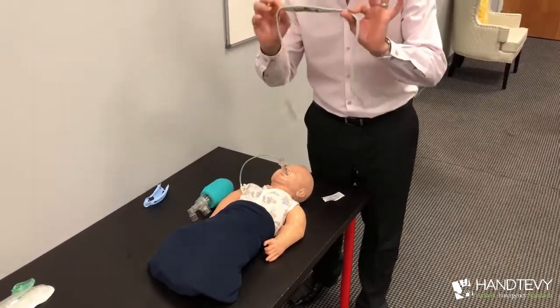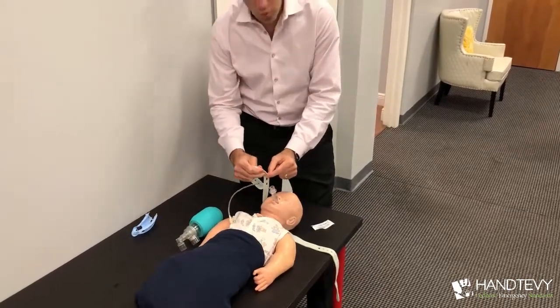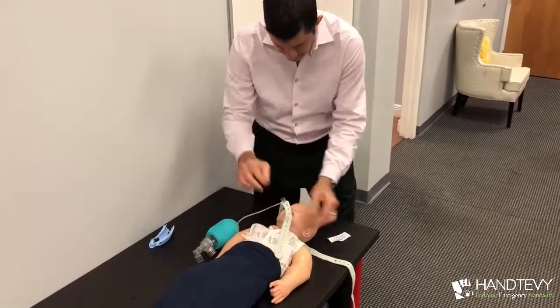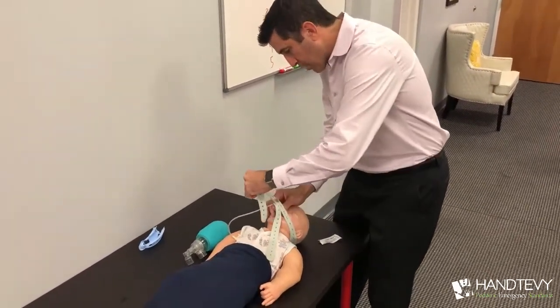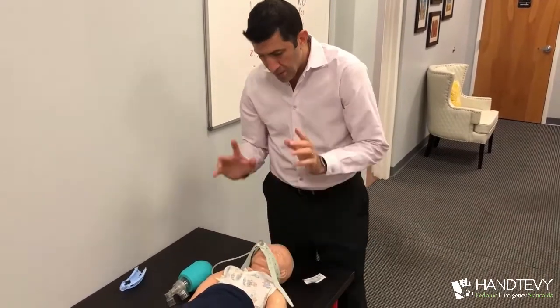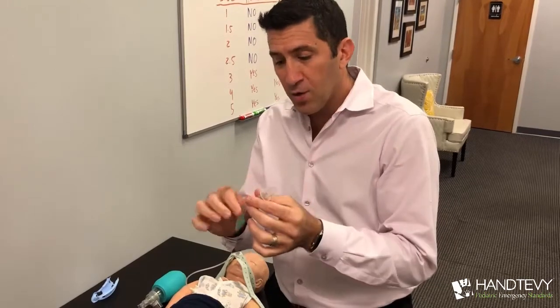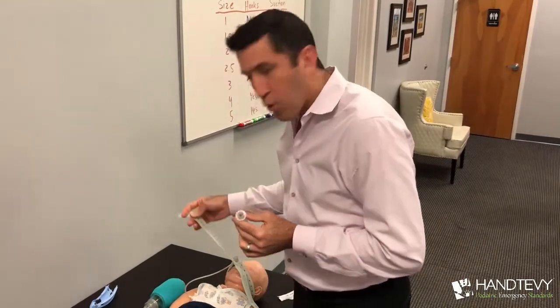The question is how do we secure this? What we've learned is we can take the same strap, put it behind the child's head, come up and use the hole in the strap on one end, then bring the other side around and do the same thing. So now you have an i-gel that's secured with that same strap — that works up to size 1.5. You can't do that with size 1, because the holes in the strap don't extend far enough and the strap becomes too big. To secure size 1, you have to use either tape, or we've successfully used co-band. I'm hoping the folks at Intersurgical can make a few more holes in that strap so we can use that same technique on all i-gel sizes.